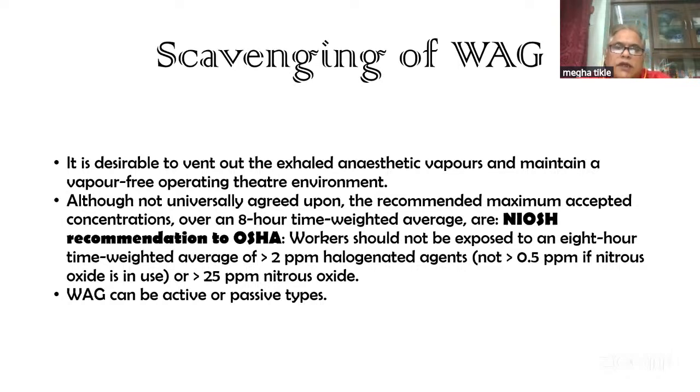So, although not universally agreed, the recommended maximum accepted concentration on an 8-hour time weighted average is that the concentration should not be more than 2 parts per million for halogenated agent, not more than 0.5 if nitrous is used in conjunction, or more than 25 parts per million for nitrous oxide. Now, WAG can be active or passive, both ways. So you can actively take away the gases from the anesthesia machine and safely dispose it off into the atmosphere, or it can passively get disposed of via certain canisters of activated charcoal or zeolite crystals, which absorb gases and they can be reused again after reactivation.